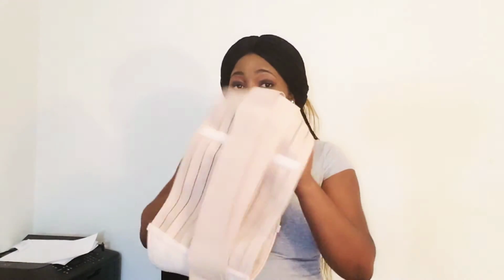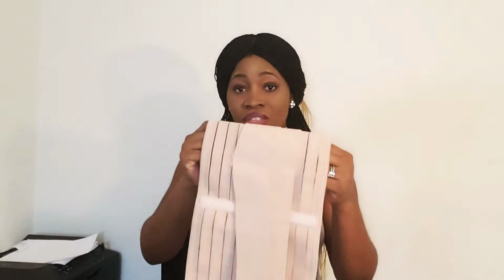This waist belt would help you stand properly like this, and as you can see in the video, it snugged me up, and I was trying to adjust my waist with it. This waist belt will give you that support you need to walk around. I had this belt on mostly all my stay in the hospital, and it helped me walk up and down the hallway.